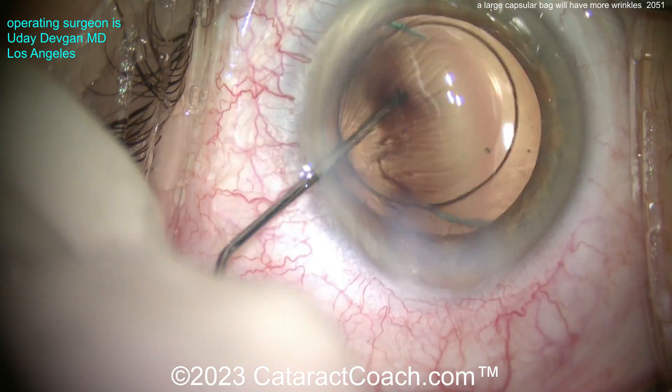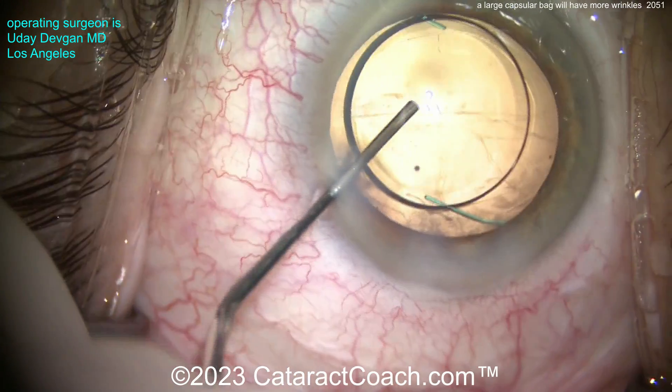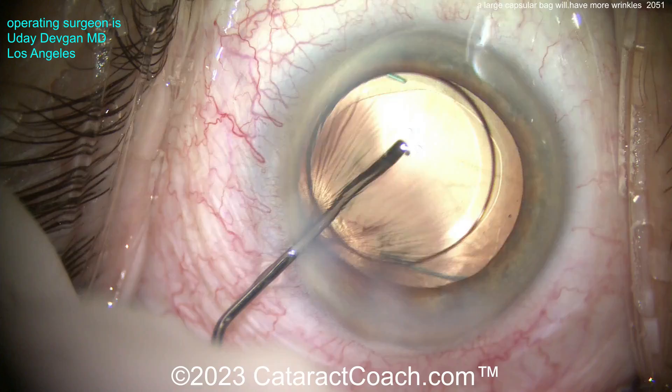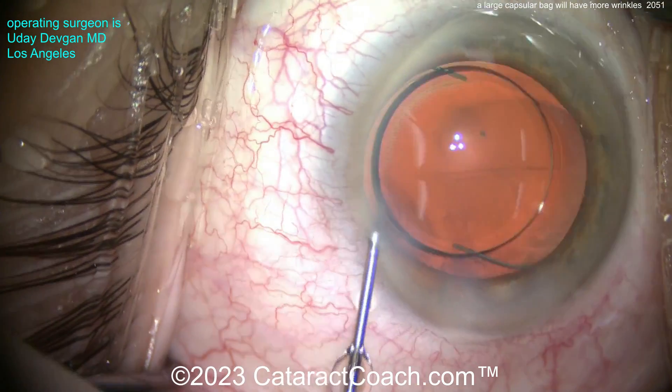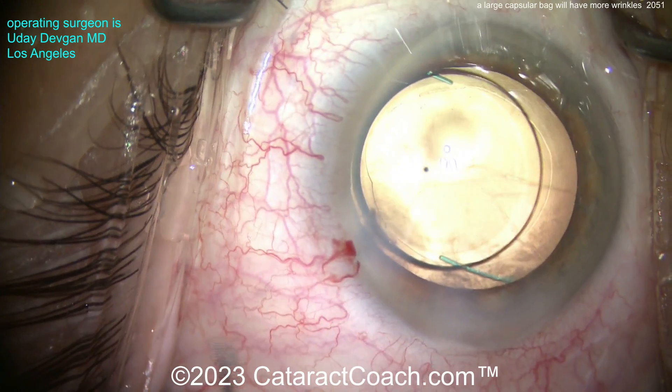You can still inflate the eye a little bit more to push those wrinkles out, then keep the eye inflated at the end. Now see the wrinkles at the inferior haptic-optic junction. When you fill the bag up you're going to have a lot less of those. There we go — this will tend to stick in place. We're pretty happy; most of the wrinkles are out. On to the next case.